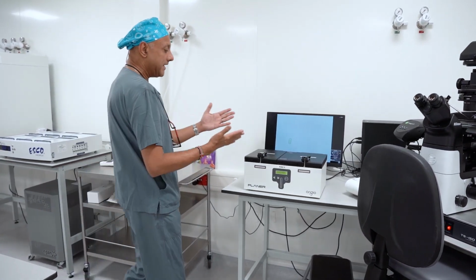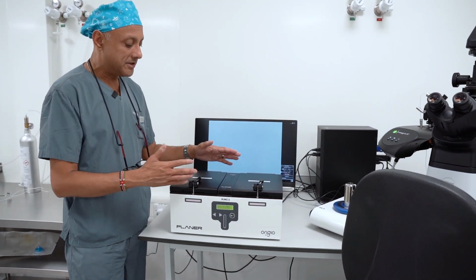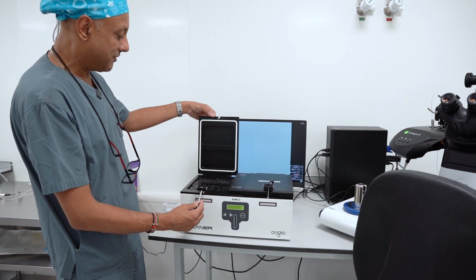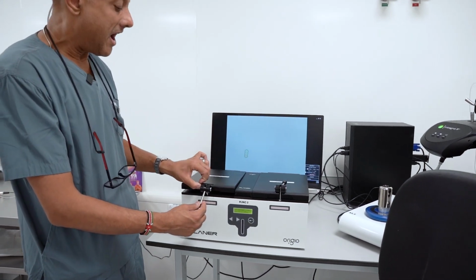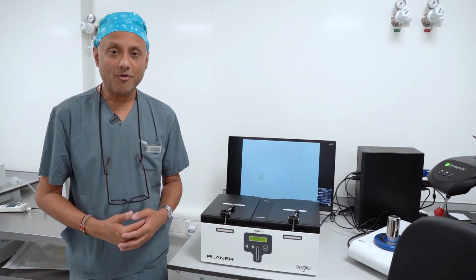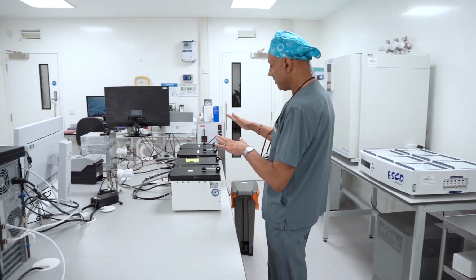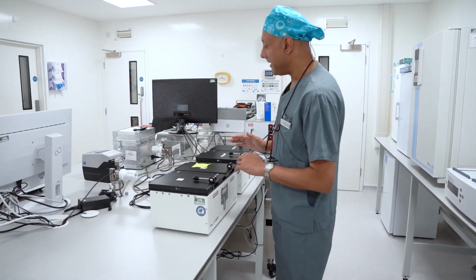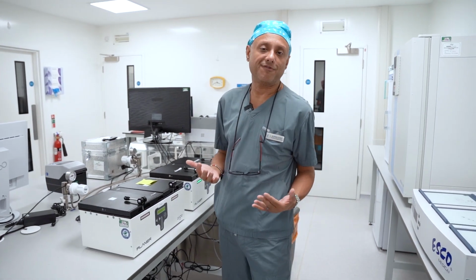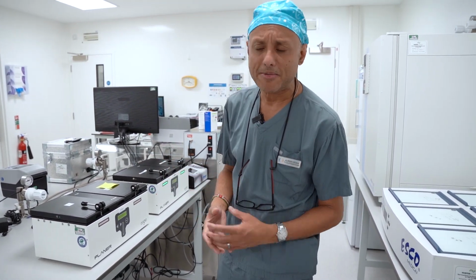We then move on to incubators like these, which are called benchtop incubators, which typically have the access that you can see there, and dishes are kept within this incubator chamber to develop overnight. We have more such incubators here. So we've got 2 more benchtop incubators in this lab. And as you can see, we have plenty of space within the laboratory as well. It's not a crowded lab at all.